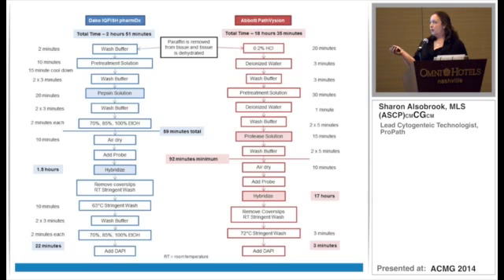And this 1.5 hours hybridization has really improved our overall workflow versus an overnight hybridization. And this, again, is just for HER2. That means you're going in 1 day from starting the process to being able to counterstain to analyze versus an overnight process.